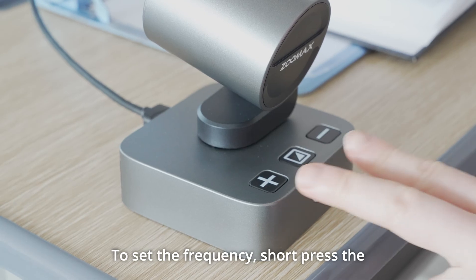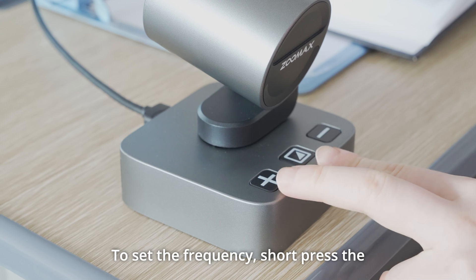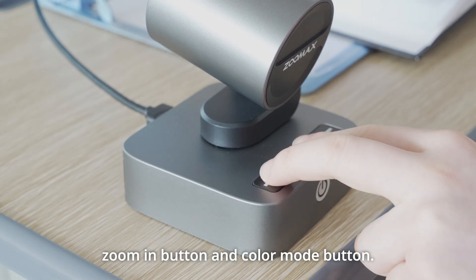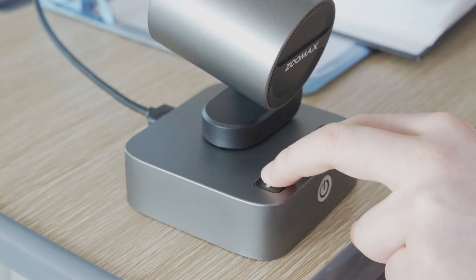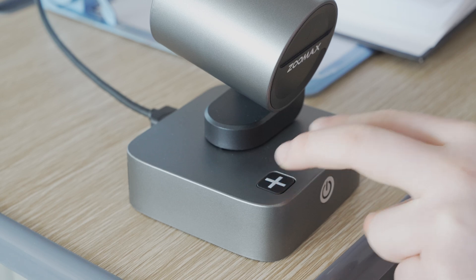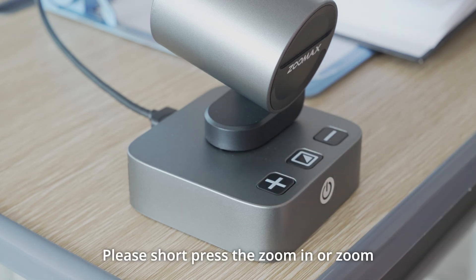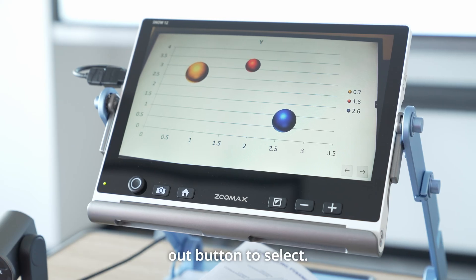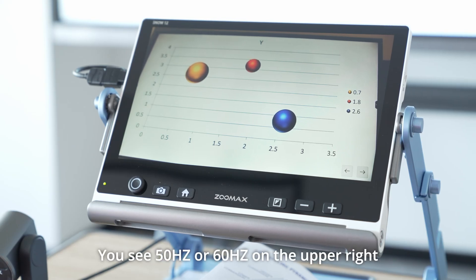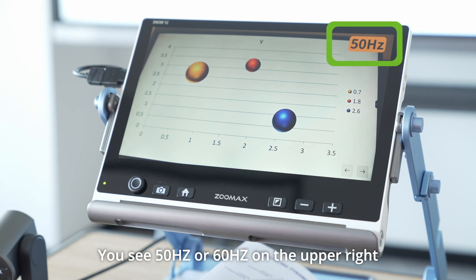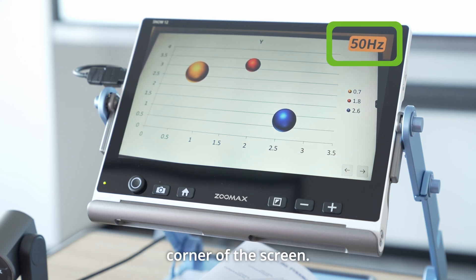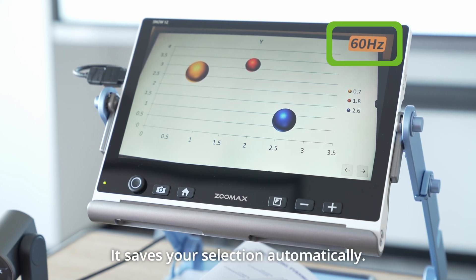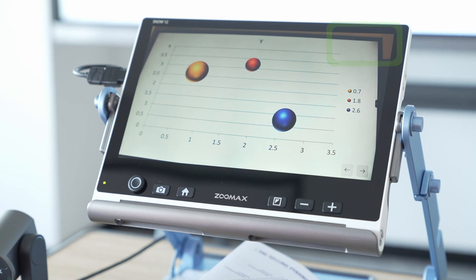To set the frequency, short press the zoom in button and color mode button. Please short press the zoom in or zoom out button to select. You see 50Hz or 60Hz on the upper right corner of the screen. It saves your selection automatically.